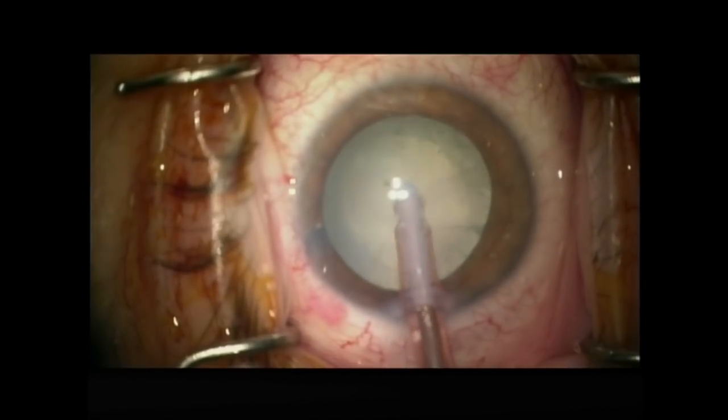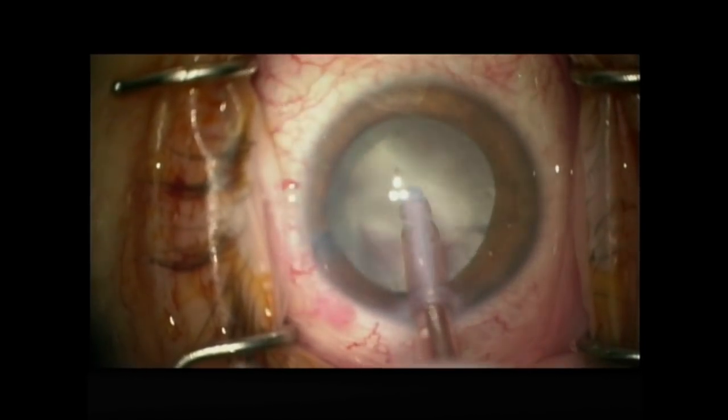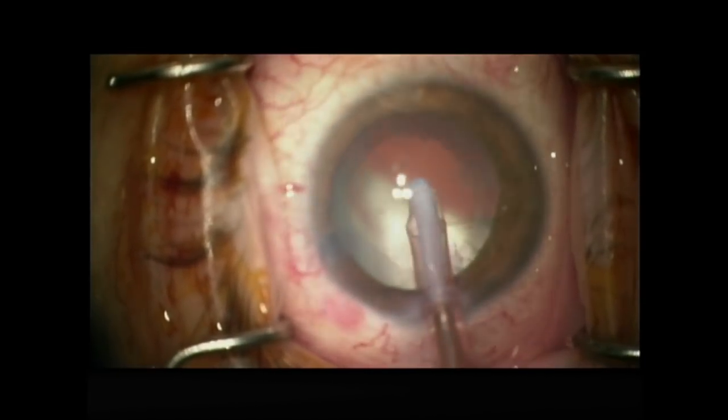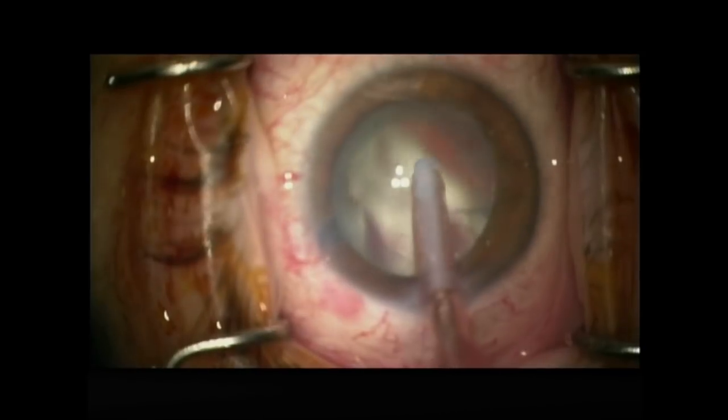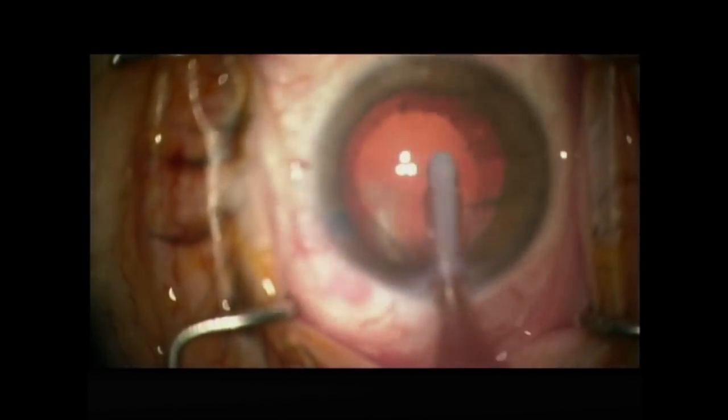The I/A was then directed through the posterior capsule tear into the vitreous cavity and the white cortical material was removed. We can also see a large nuclear fragment was also in the vitreous cavity, but this was not able to be removed by the I/A.